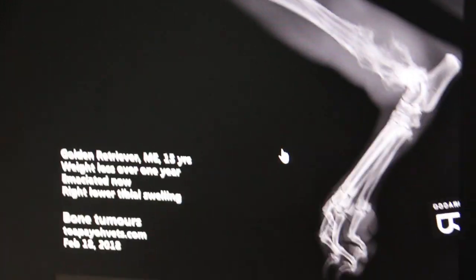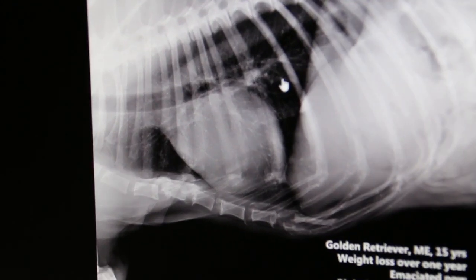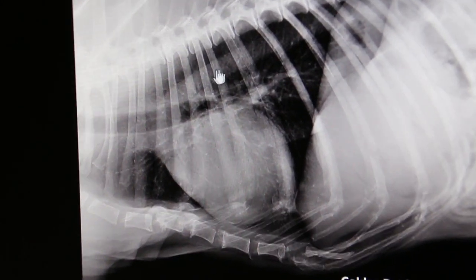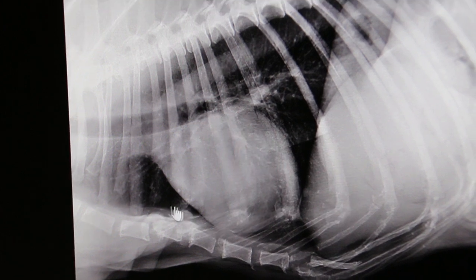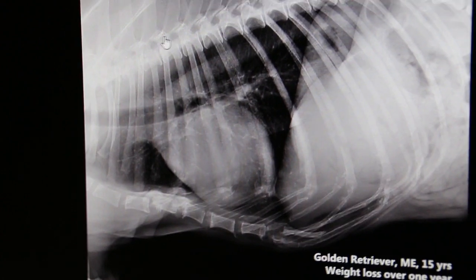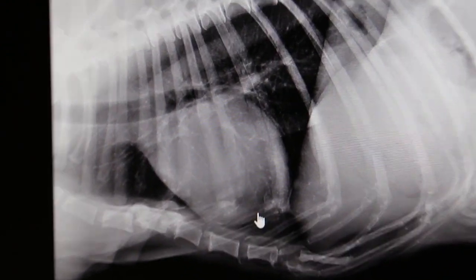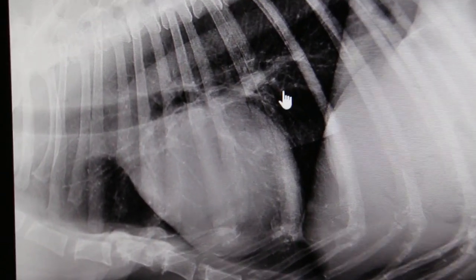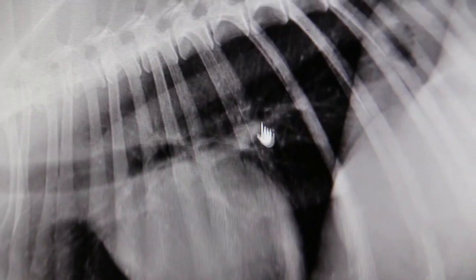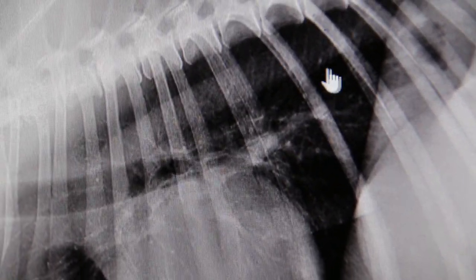The word emaciated is noted here in the x-ray. The vet also showed the lungs to see whether the bone cancer has spread to the lungs, because that is the most common place it spreads. You can see some lung nodules here, but not very big ones. So most of it is just spread, and it has not fully spread.